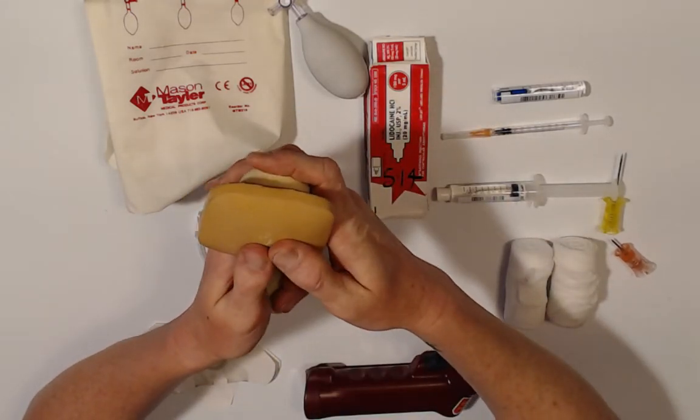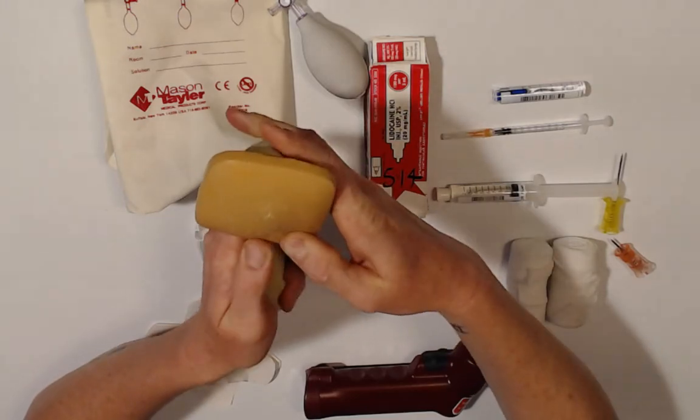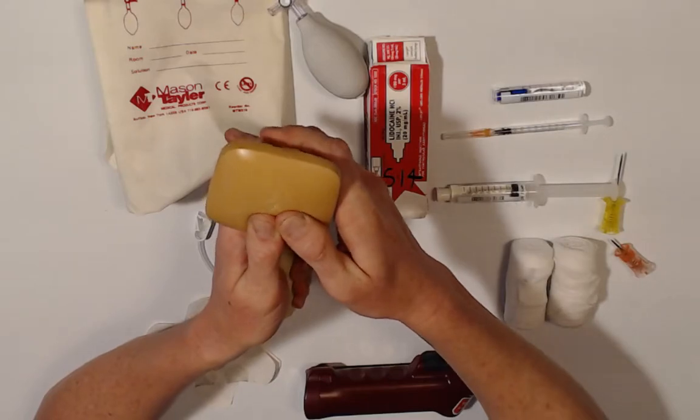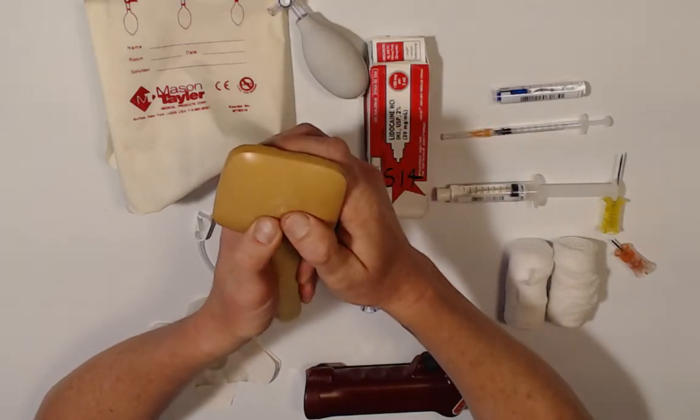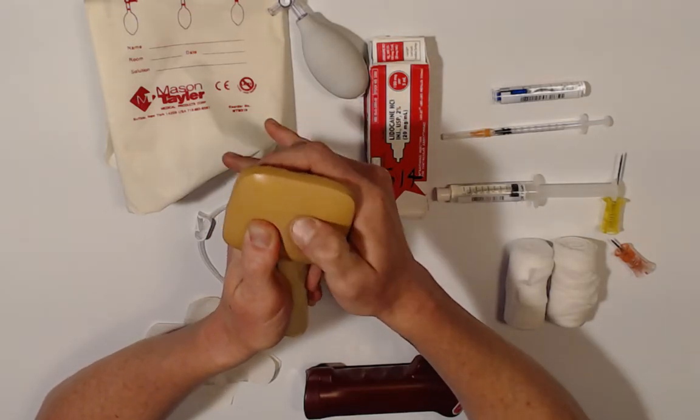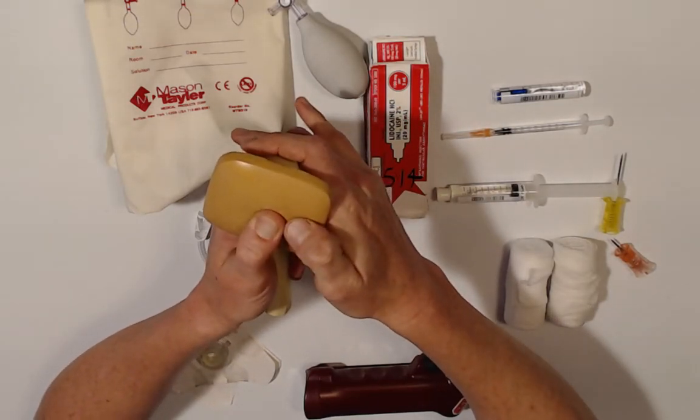Now we're going to try to palpate around. You find the humerus, and as we come up, we're going to feel where that ball starts to protrude out. We actually want to go on that most protruding spot of that humeral head. Okay, so palpate, nice and easy there.